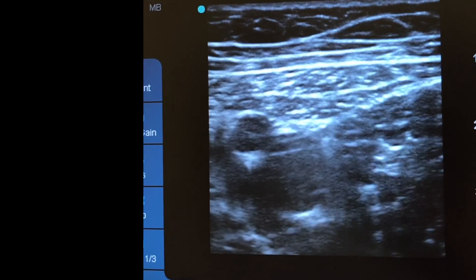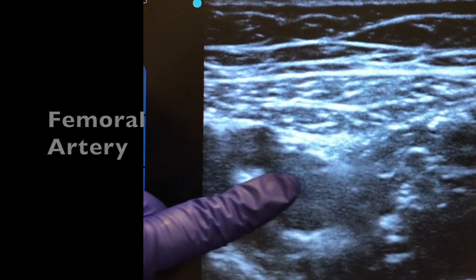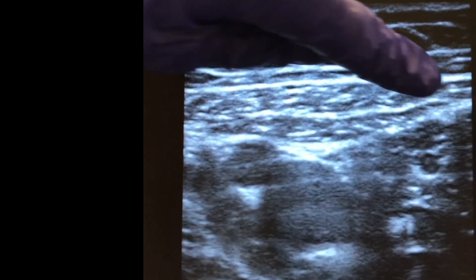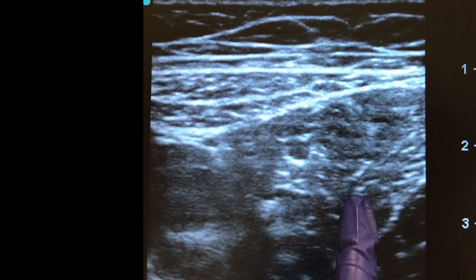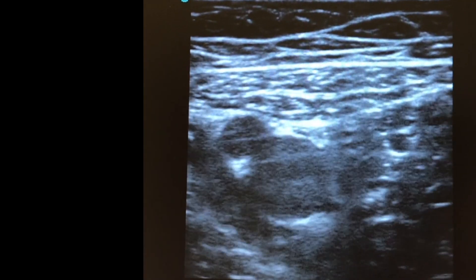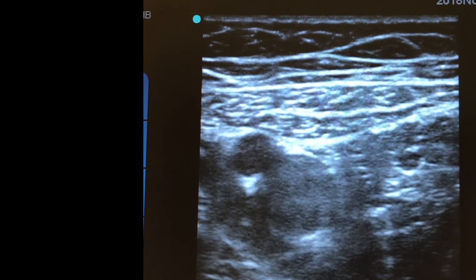Now finding the adductor canal for a saphenous block. On the ultrasound you can see the femoral artery, and next to it the compressible femoral vein. Right next to the artery and above the vein is the saphenous nerve — the hyperechoic area. Key muscle landmarks: the sartorius is the boat-shaped hyperechoic muscle, the vastus medialis is lateral and slightly hypoechoic, and the adductor longus is medial — together forming the adductor canal. The needle comes down between these muscles and injects next to the nerve, then hydrodissects it before injecting more local anesthetic beneath.